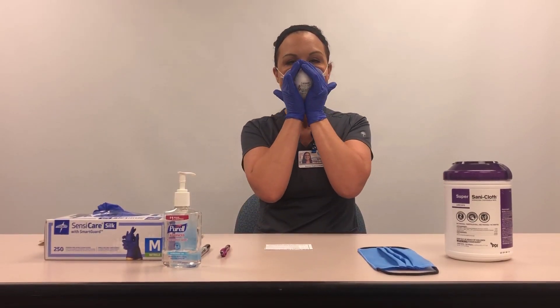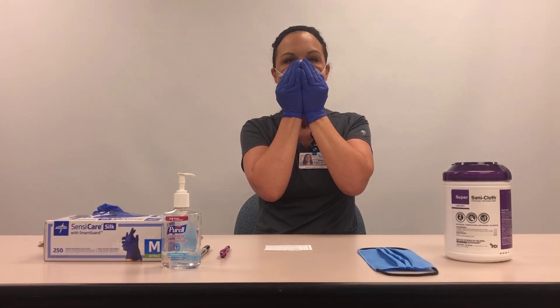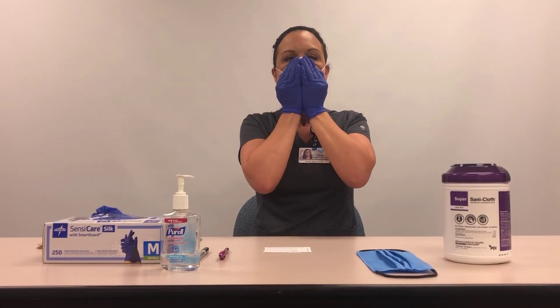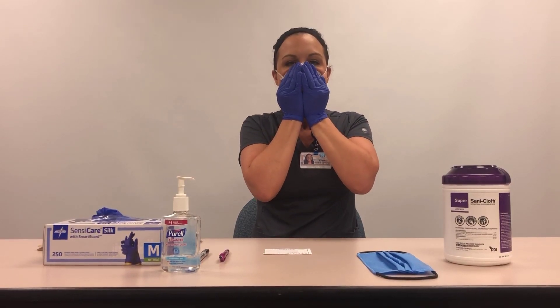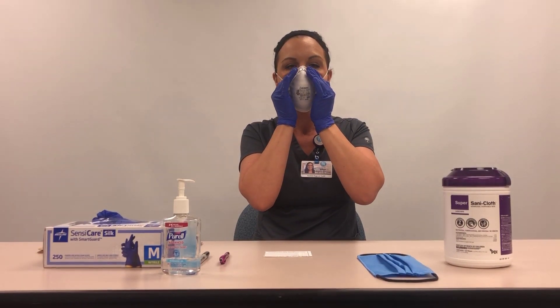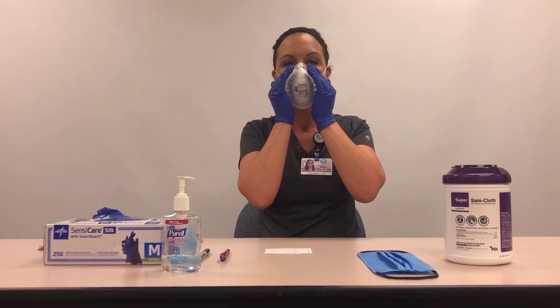Perform a seal check. Place both hands over the respirator, covering as much surface area as possible. Take a quick breath in to ensure the respirator pulls in against the face. Gently exhale. Feel for air movement on the skin along the edge of the respirator.